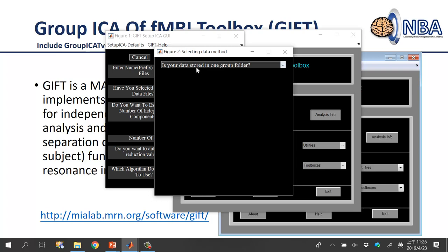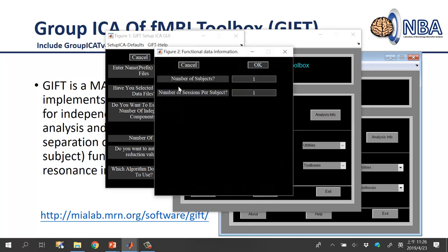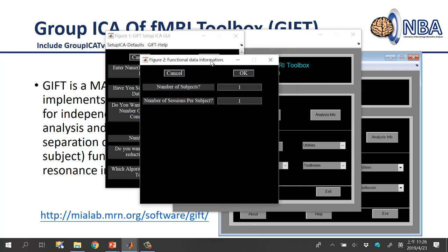It will ask if your data is stored in one group folder. I prefer to select 'No' and manually select data. If you choose 'Yes', all files must be in one folder with a similar naming structure. Selecting 'No' prompts a window asking how many subjects — enter 2 — and how many sessions per subject — enter 1.